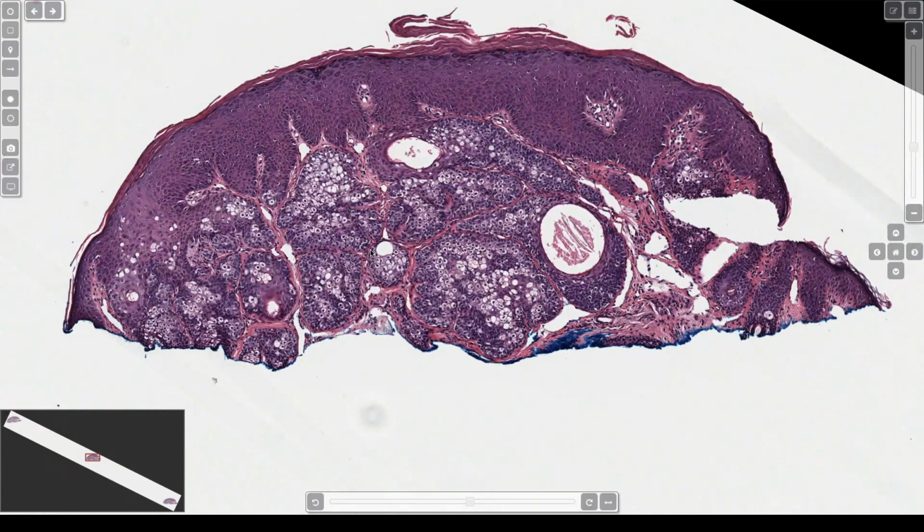We don't routinely perform the stains for the mismatch repair genes, but we will do it upon request. Different people have different ways they handle that. So we just usually put that comment in the report and let the treating physician decide how they want to address it depending on the patient's clinical situation. I find that you should not have marked atypia, you should not have atypical mitosis, and you should not have infiltrative growth. Those are worrisome signs for sebaceous carcinoma.